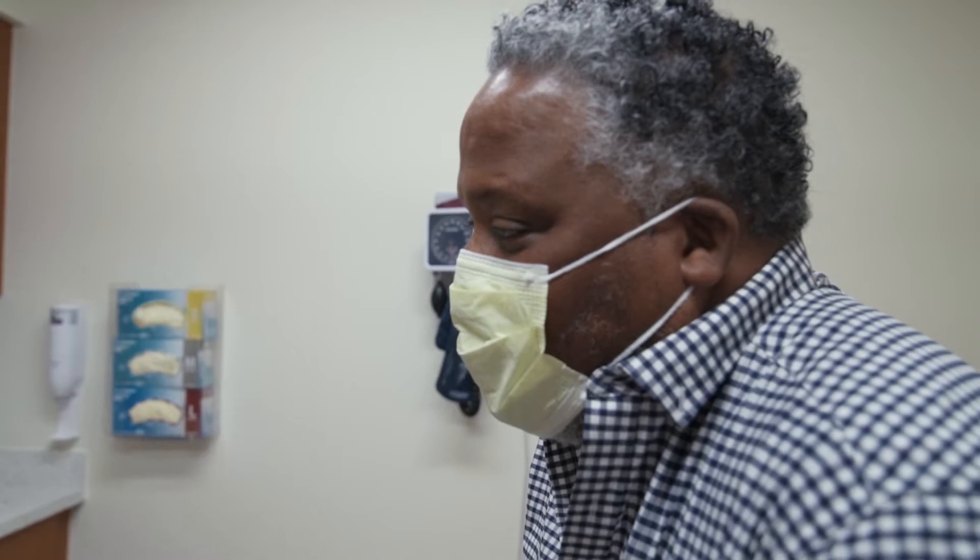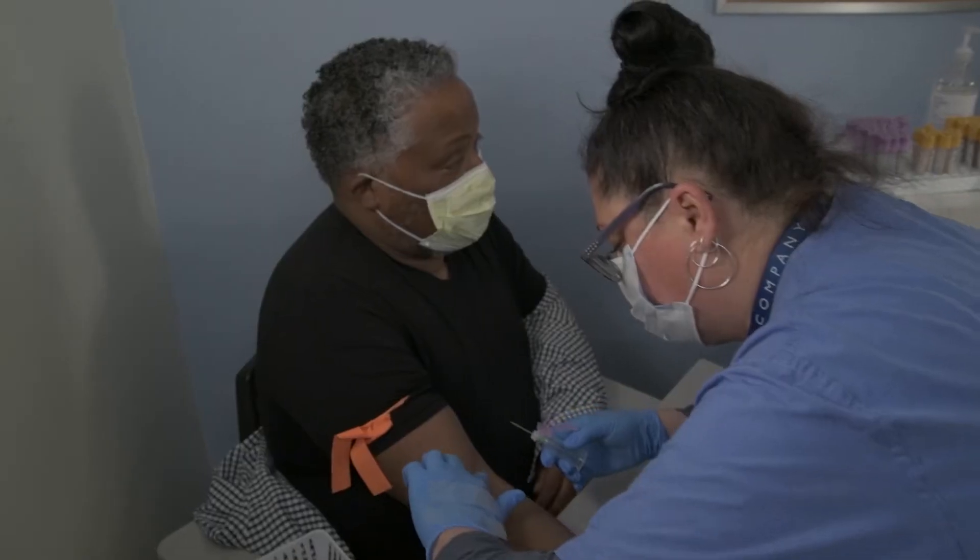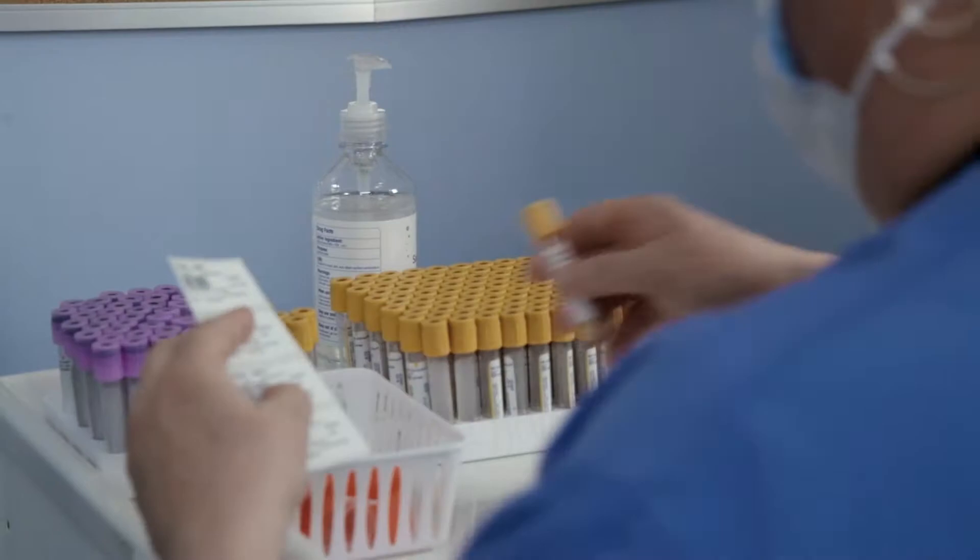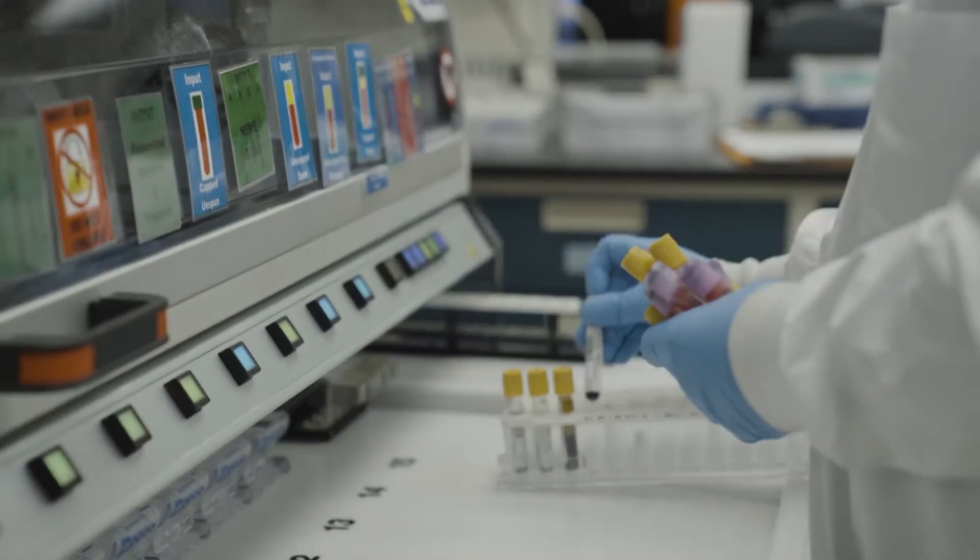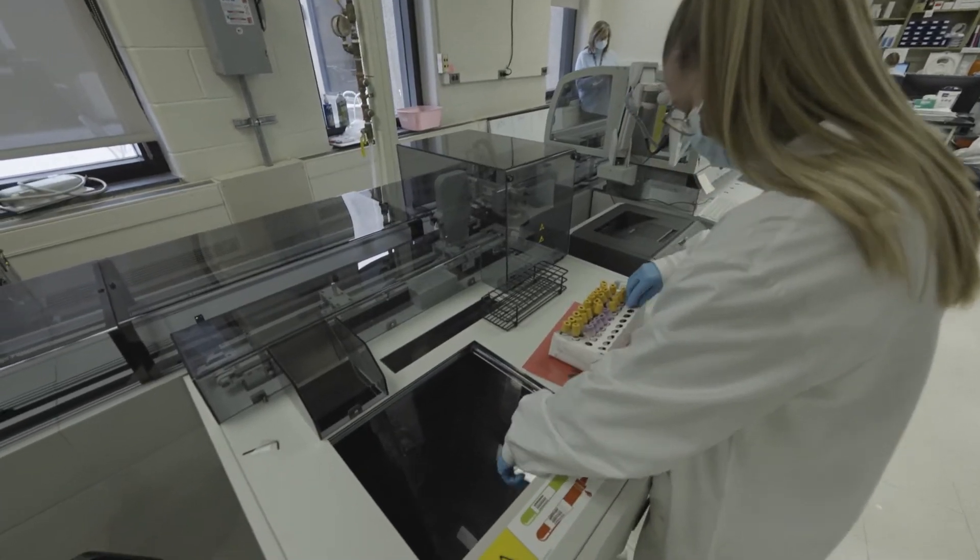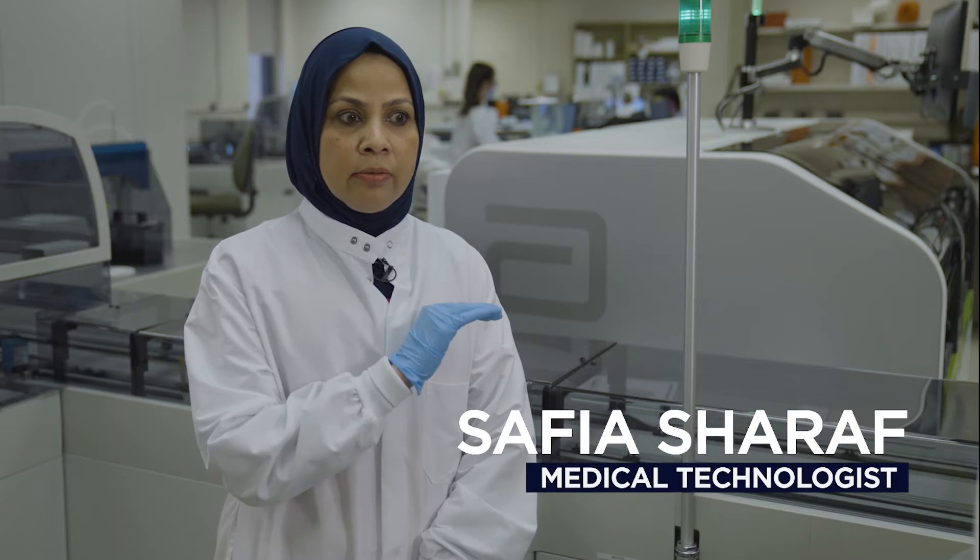As soon as the doctor puts the order in, we have the order in the system. Phlebotomists draw the tube and as soon as we receive the tube, we load it on the system and the system knows what to do with this order.